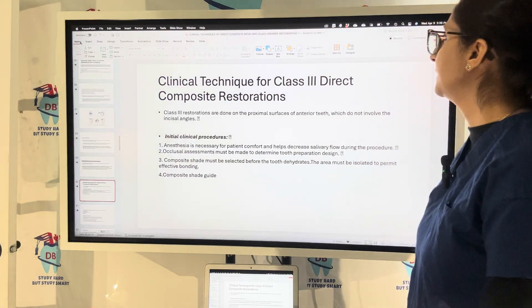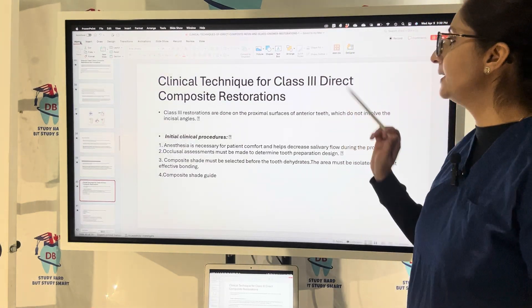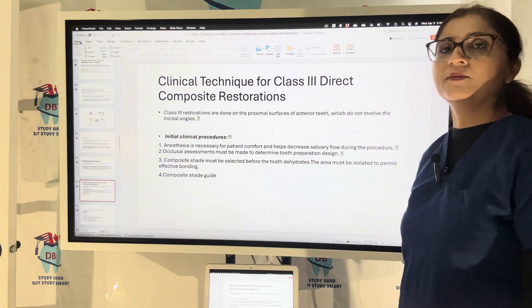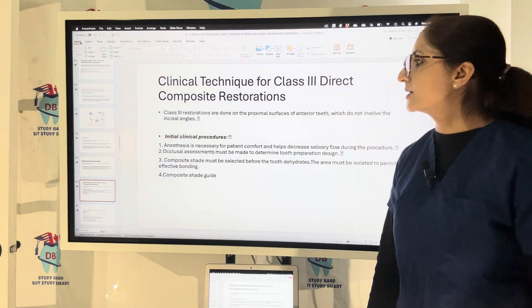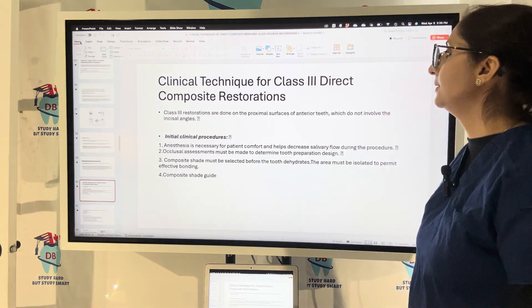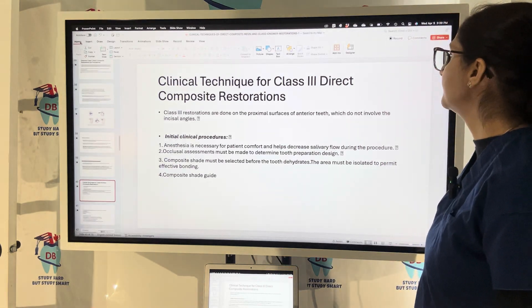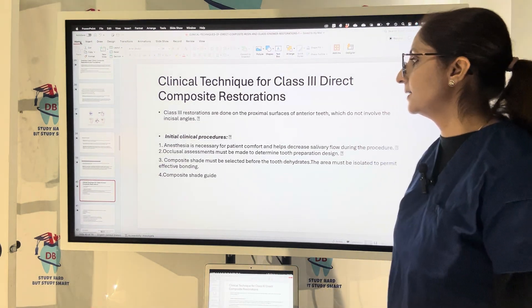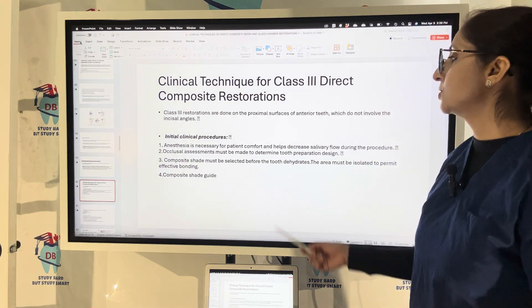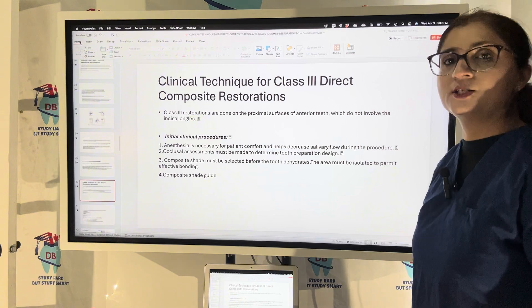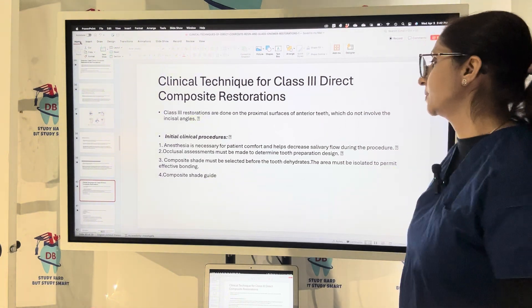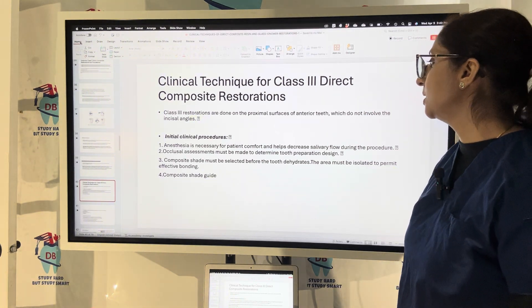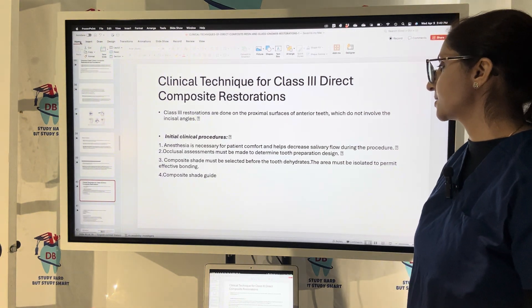Now let's see the clinical technique for Class 3 direct composite. Class 3 is in the aesthetic zone and is done on the proximal surface of anterior teeth not involving the incisal angle. First, anesthesia is necessary for patient comfort, decreased salivary flow, and occlusal assessments.